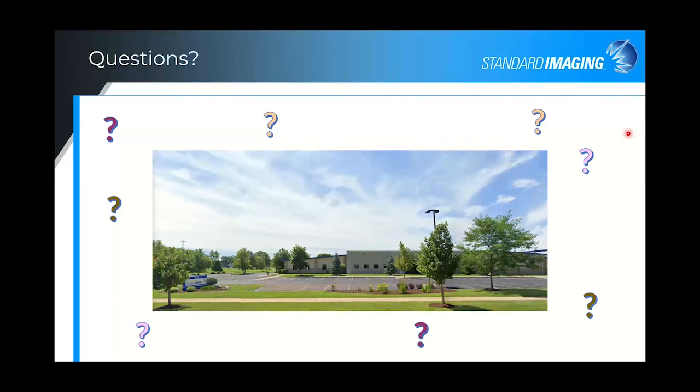Other things happen, like the gantry motion. That's a known issue at the start of some treatments in older Clinacs, and so you might just have to see that, oh yeah, the gantry mechanism is sticking a bit, and we need to go in and have some maintenance done. But mostly, I think a lot of it has to do with the complexity of the plans and the age of your Clinac. And you might start seeing things that would indicate, if you're getting near your alerts, it might be time to have some Clinac maintenance performed.